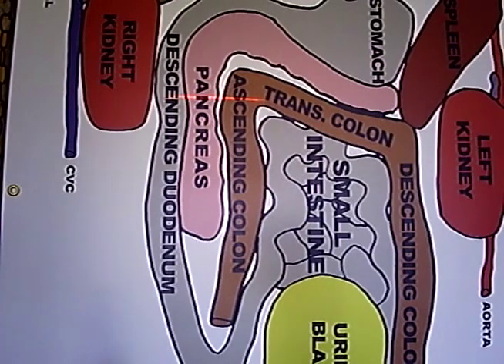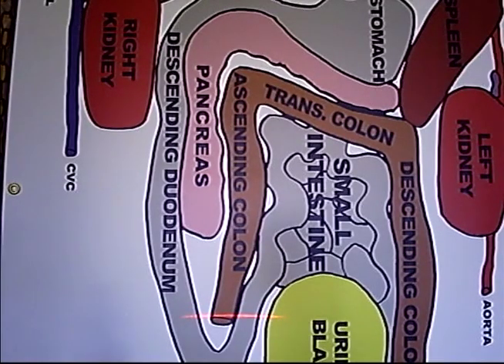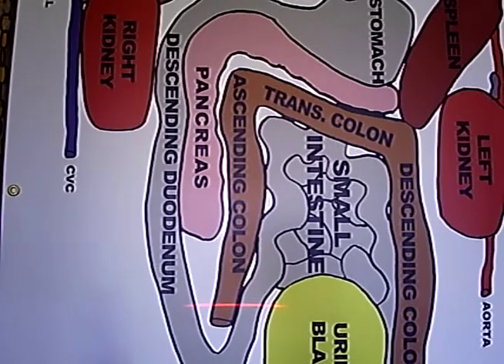Normal colon is usually easily recognized in the abdomen. Obstructed small intestine or foreign body of the small intestine often has the same ultrasound appearance of colon. To positively identify the colon, it may be easiest to begin with the ascending colon in the right mid-abdomen. With the transducer in a transverse position, follow the ascending colon cranially till the short axis ascending colon becomes a long axis transverse colon.